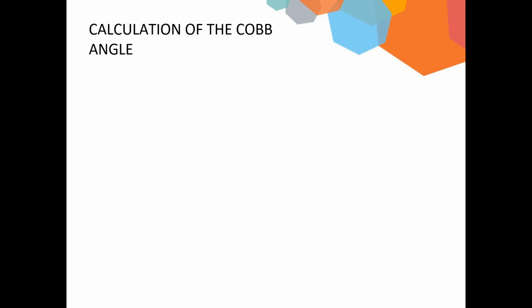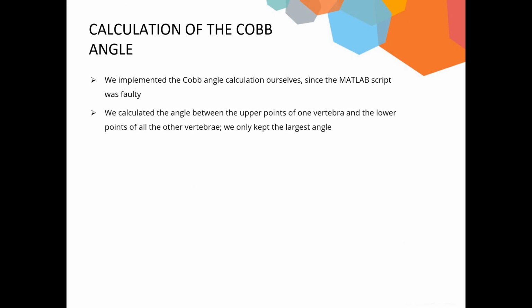We had to calculate the Cobb angle ourselves since the MATLAB script provided in the dataset was faulty. We calculated the angle between the upper points of one vertebra and the lower points of all the other vertebrae. We only kept the largest angle.